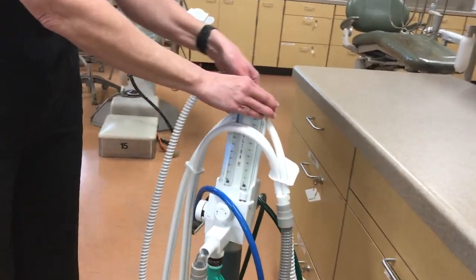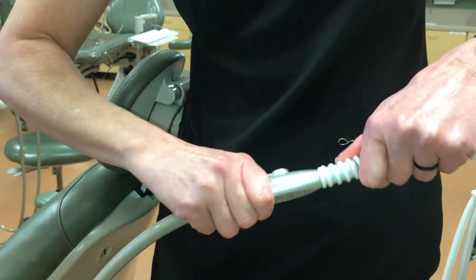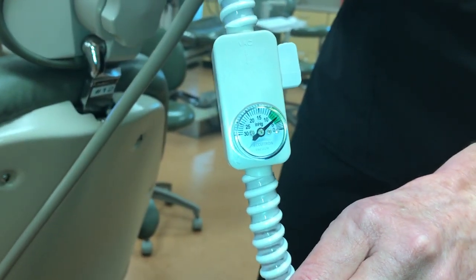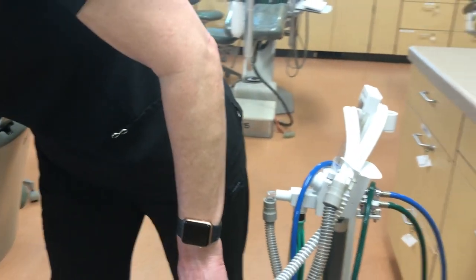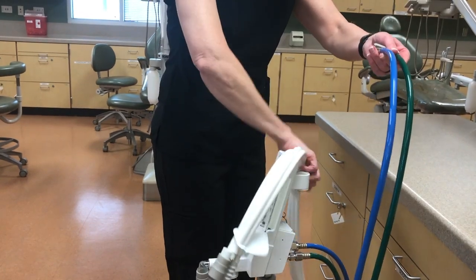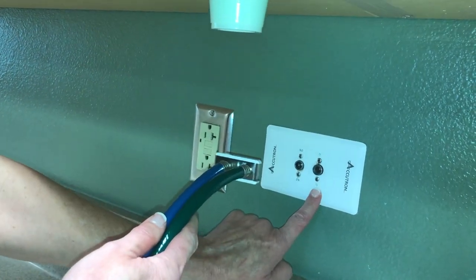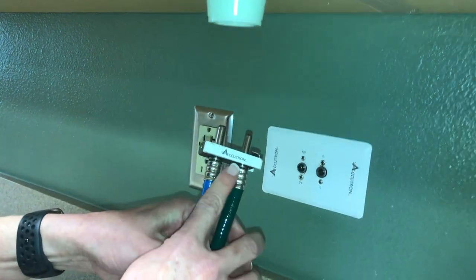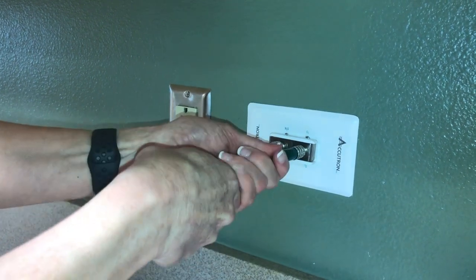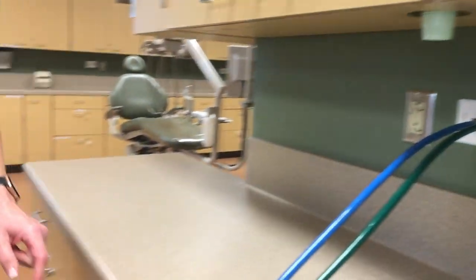This is the analog unit. You will need to use the vacuum tubing to connect to the high speed suction. You will turn on the high speed suction and check the vacuum gauge to make sure the scavenging system is working correctly. Once confirmed, you will attach the tubing for nitrous oxide and oxygen to the central panel. Note that the oxygen is on the right in green, the nitrous is on the left in blue, and the Accutron word is facing upward. You will push straight in until you hear a click, and gently pull back to confirm it is secure. This button on the right can be depressed when removing the tubing at the end.